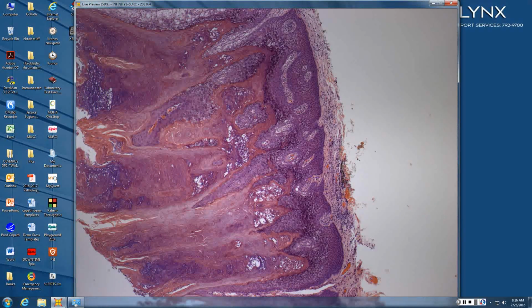That's epidermolytic. An epidermolytic acanthoma, and 90% of these are located where? 90% are genitalia. Okay. So 90% are genitalia. There have been numerous studies to see if they're HPV-induced. They are not, according to all the studies to date.